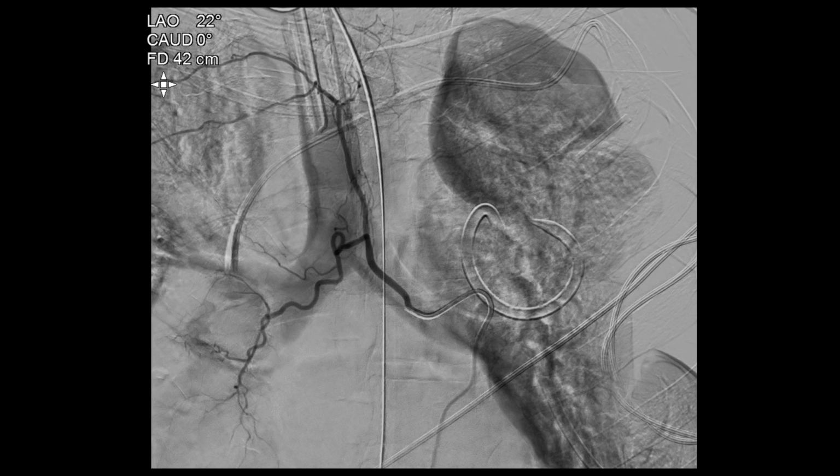And it's very rare that we'll actually see active hemorrhage in a bronchial artery, but what you'll typically see is enlargement and tortuosity within abnormal vessels. So this is a little bit enlarged and it is a little bit tortuous, and actually we can see some parenchymal enhancement, which is another odd finding. So all three of the angiographic findings and then also the clinical finding from the pulmonologist tell us that this is probably the source of the hemorrhage, so we want to treat it.